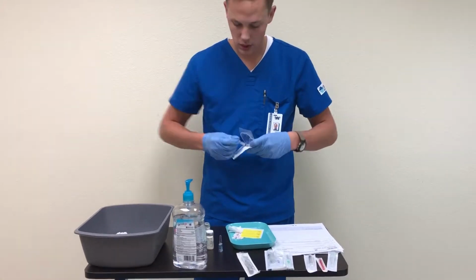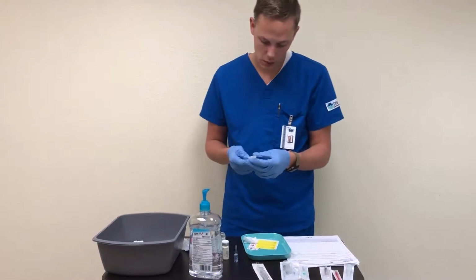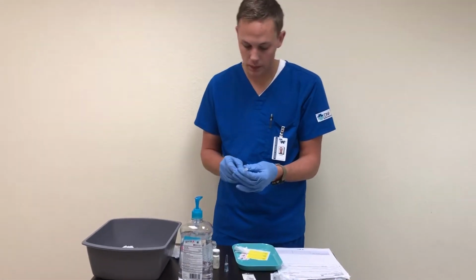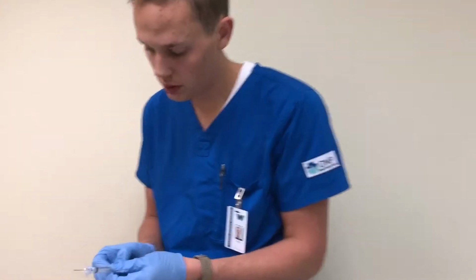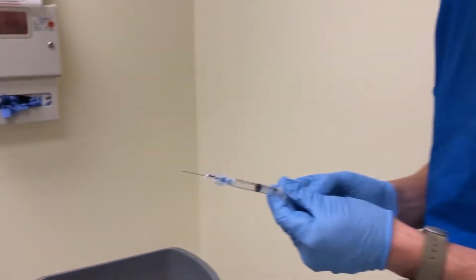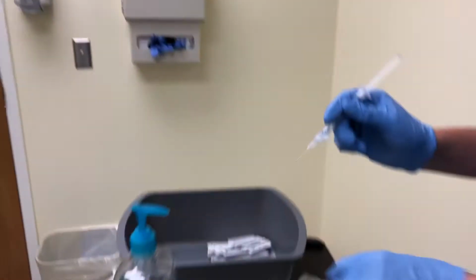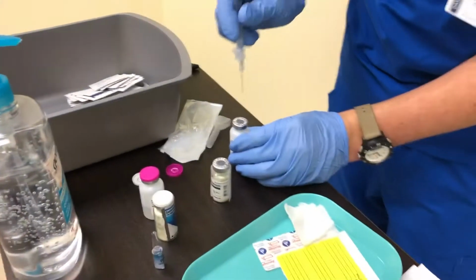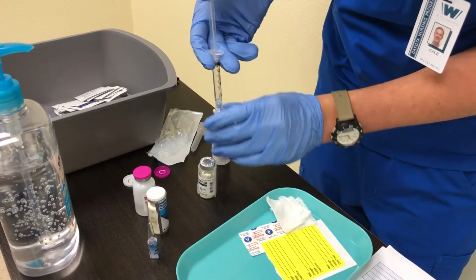I twist it on. And I will be pulling in 3 mils of air. So there's my 3 mils of air. And then it's just going to go into the sterile water. And push it in.